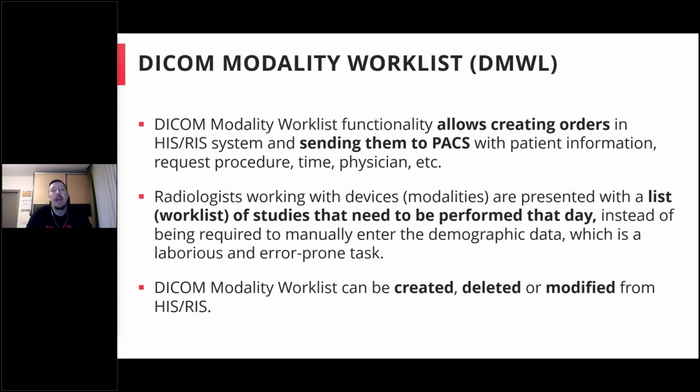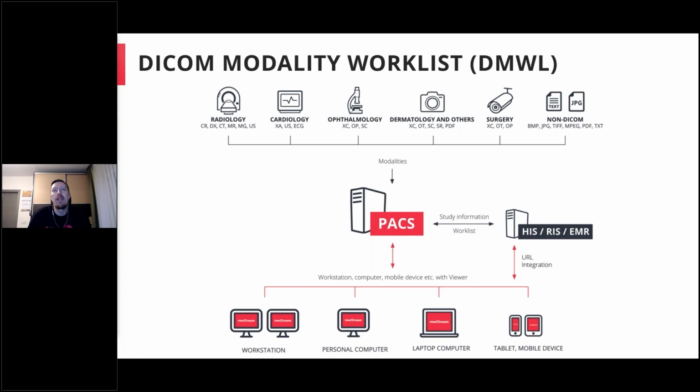And usually a DICOM modality worklist can be created, deleted, or modified from the HIS system. If we look at a more user-friendly scheme, the HIS system would send a worklist order to the PACS, in this case also a worklist server.